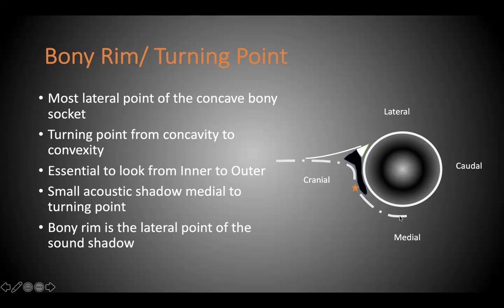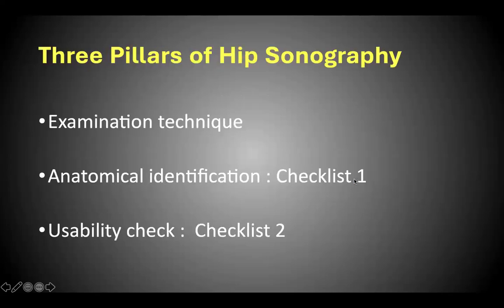So you're looking from inside to the outside, and there is usually a small acoustic shadow just medial to the turning point, and your turning point would be the lateral edge of that shadow.